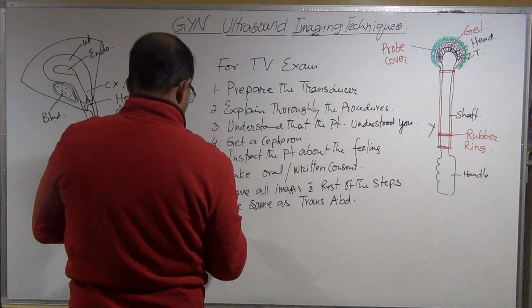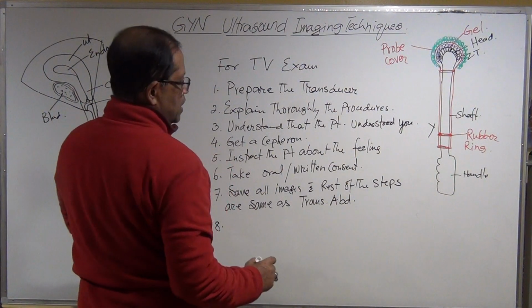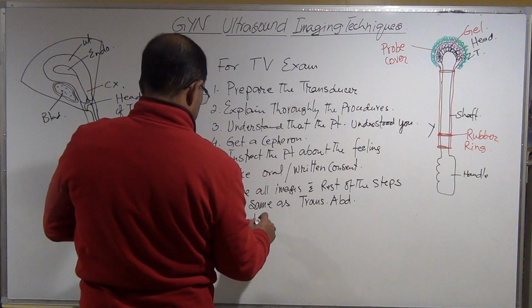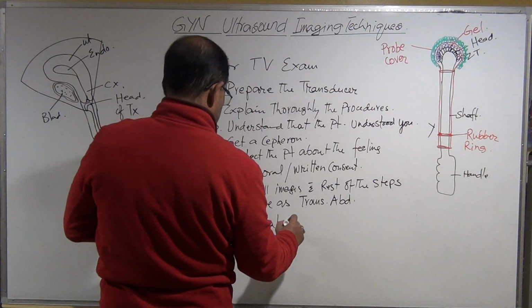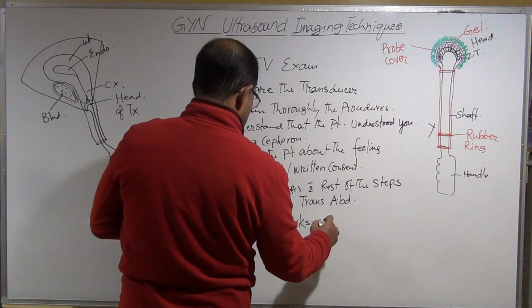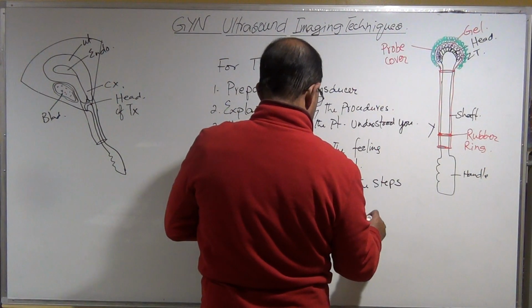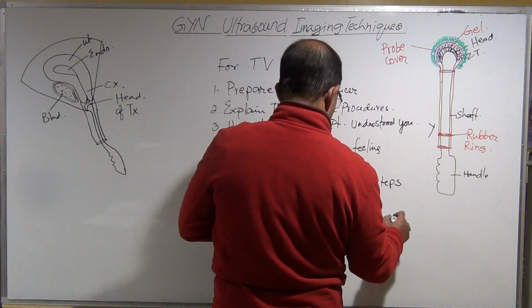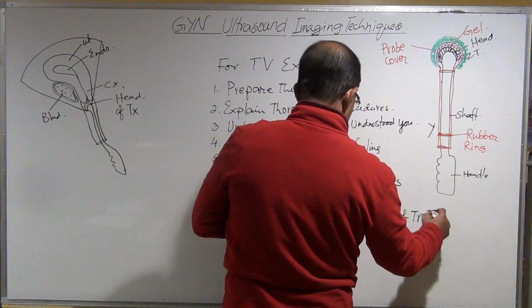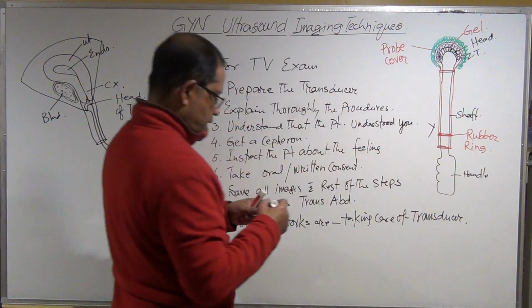So then number 8, additional work is taking care of the transducer.